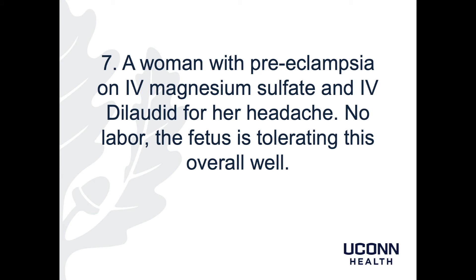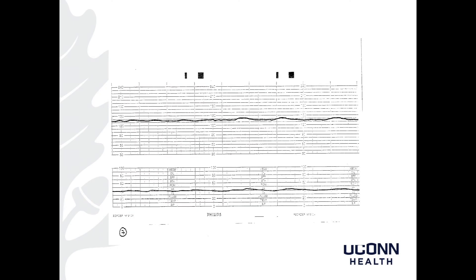Patient 7 is a woman with preeclampsia on IV magnesium sulfate who also received IV dilaudid for her headache. She's not in labor and the fetus is tolerating this overall pretty well. My read: baseline of 135s, minimal variability, no accelerations, no decelerations. This is Category 2. The dilaudid and magnesium are probably making that baby feel pretty blah — the baby's not moving around a lot, so there's very little change in heart rate. But the baseline is normal.